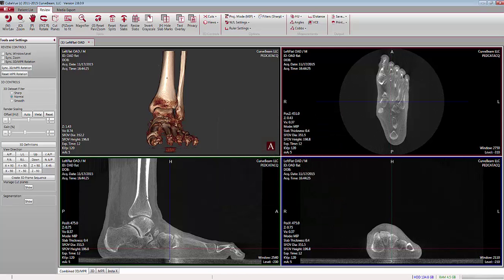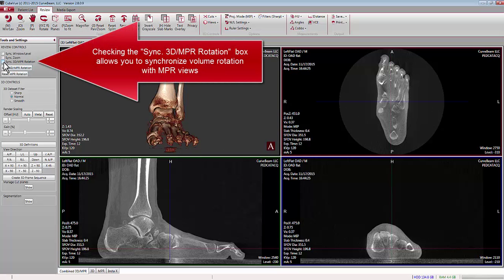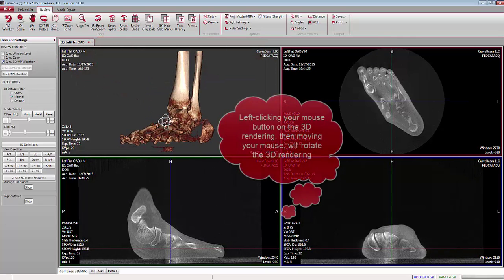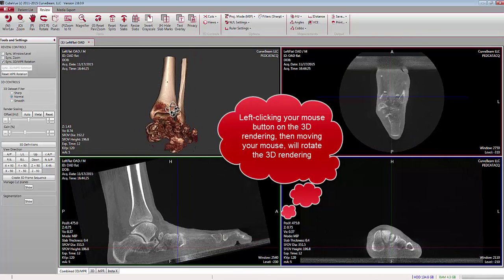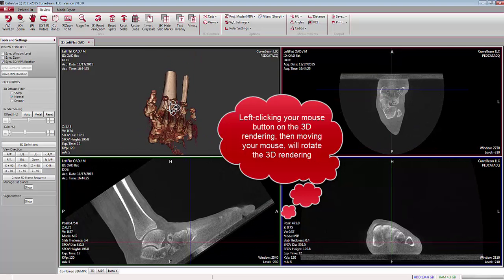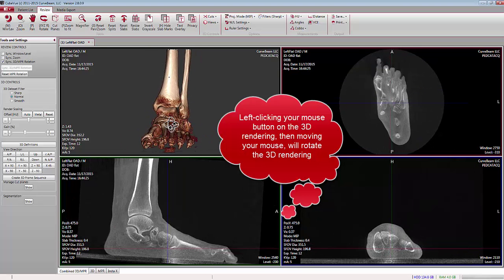All versions of CubeVue will allow you to rotate the 3D volume rendering and the corresponding MPR images if you check the Synchronize 3D MPR Rotation checkbox. Then when you grab the 3D rendering and rotate it in any direction, the MPR images — axial, sagittal, and coronal — will update automatically.